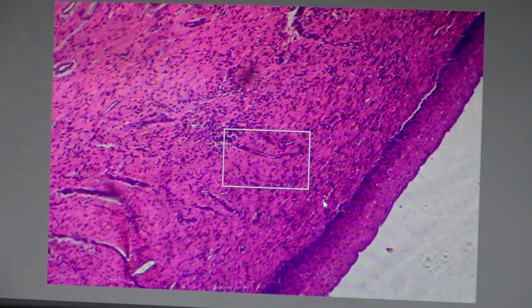This slide is regarding the pathology of the female genital tract. This biopsy has been taken from the cervix, representing an inflammatory process, what's called chronic cervicitis. In this lesion, there is benign-looking squamous epithelium underlaid by benign-looking stroma, showing chronic inflammatory cell infiltration, mainly lymphocytes.